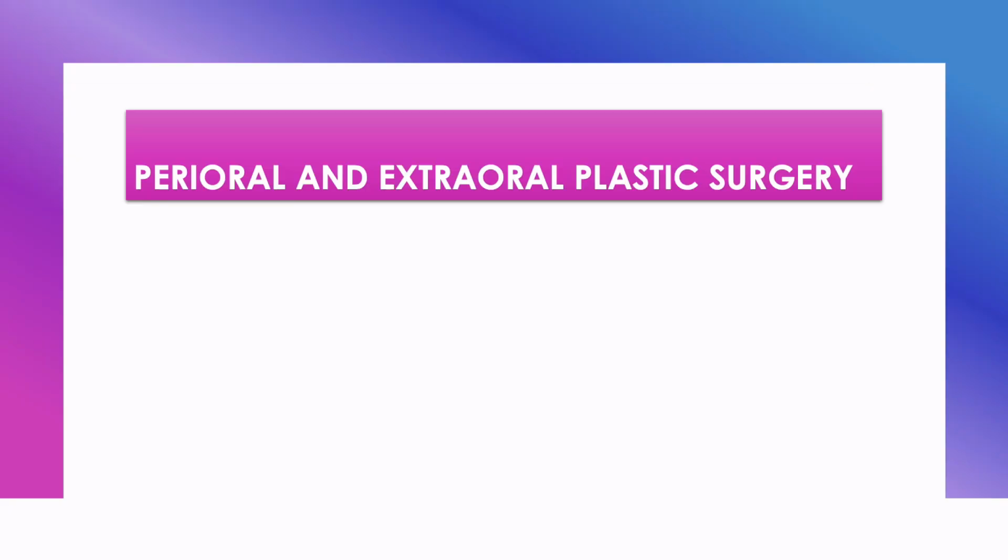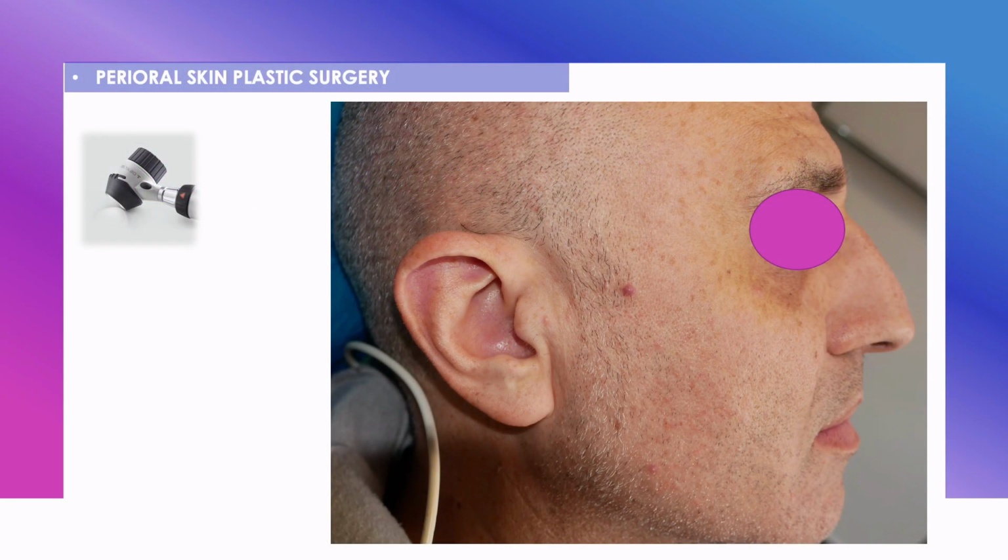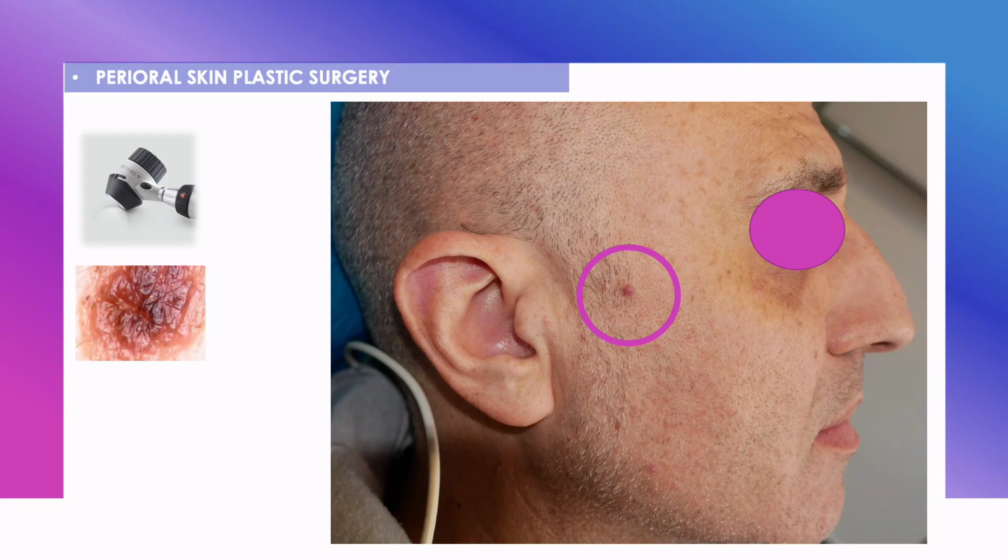Also, plastic surgery procedures can benefit from the use of modern laser systems. The present clinical setting shows us the presence of a supposed nevus located not far from the cutaneous TMJ projection area on the skin. Preliminary investigation based on dermatoscopic epiluminescence confirms our findings, and the presence of this nevus not only represents for the patient an aesthetic problem, but also a functional one, because it often damages this anatomical area during the daily shaving procedures.